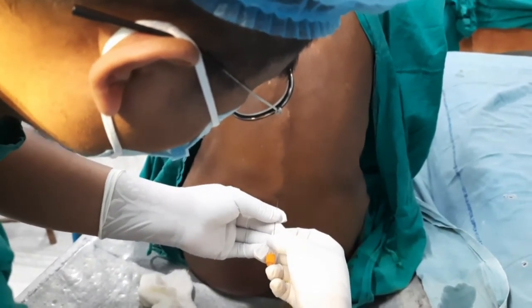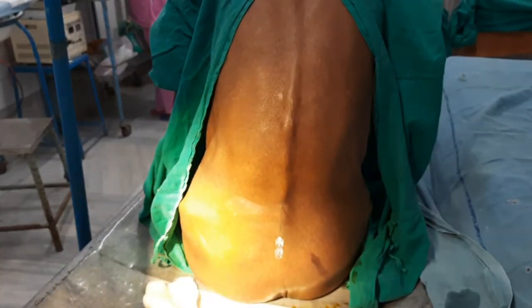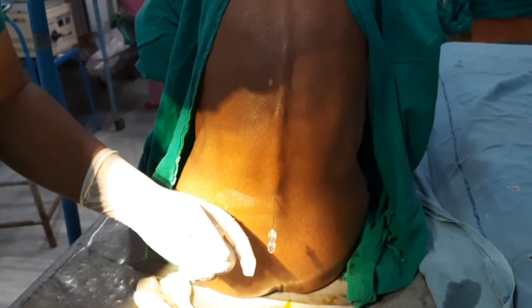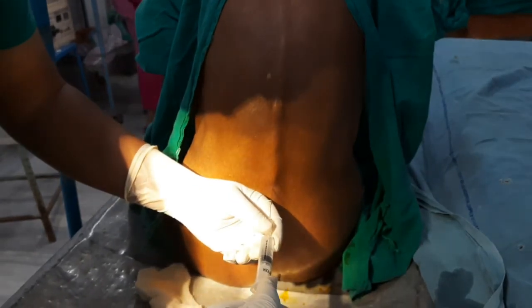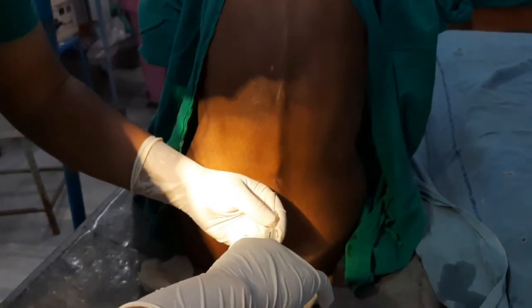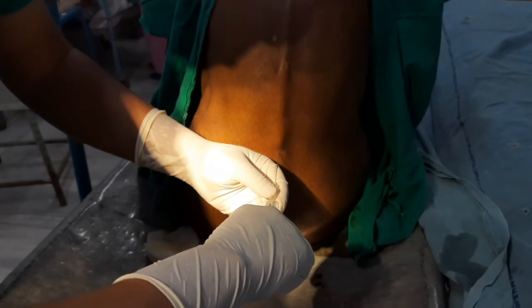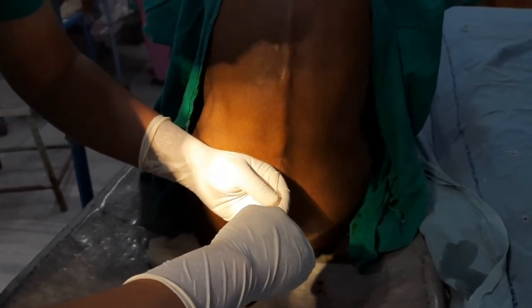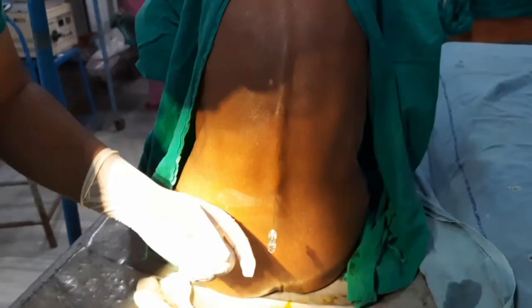Once in the subarachnoid space, remove the stylet and CSF should appear. If CSF does not appear, rotate the needle 90 degrees until it appears. If no CSF appears, replace the stylet. With smaller gauge needles, it may take 20 to 30 seconds for CSF to appear. Assess the needle position — is it at an appropriate depth? Is it midline, or is its trajectory off the midline? Being off the midline is one of the most common reasons that CSF does not come back. If off the midline, remove the needle and start over.